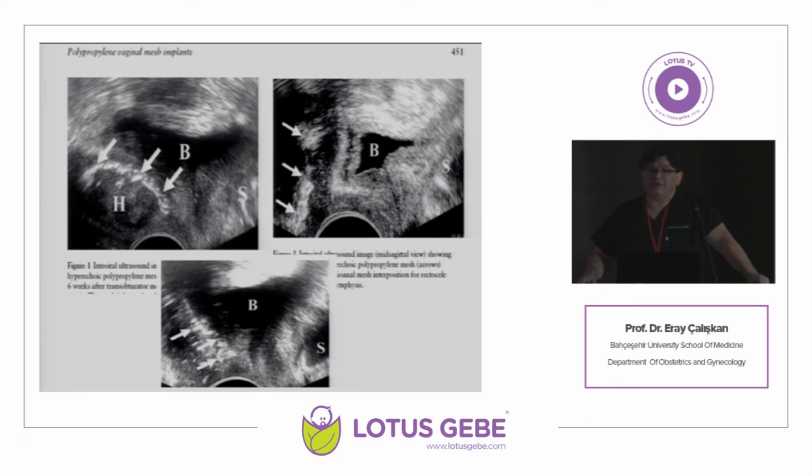You might come up with bladder papillomas, and I remember that I have diagnosed 2 cases of bladder cancer, which just came for incontinence. So just check the bladder carefully, the bladder wall and the bladder.